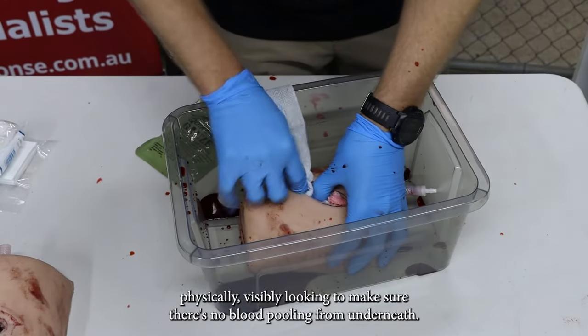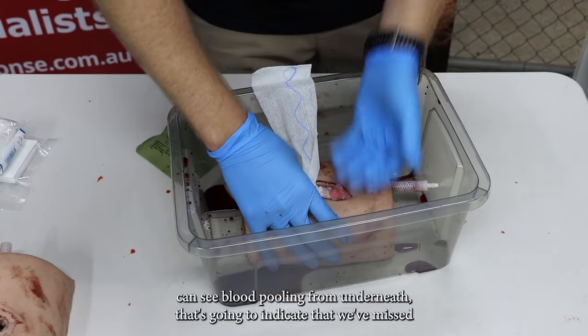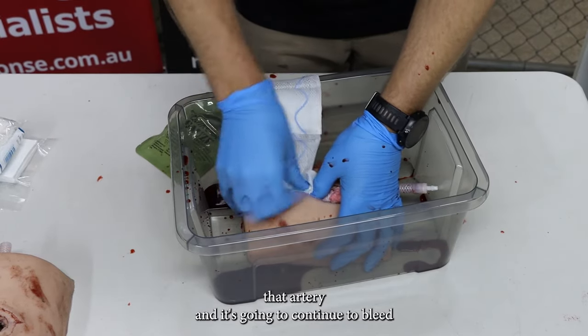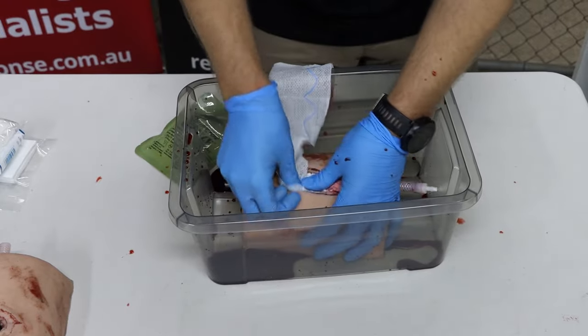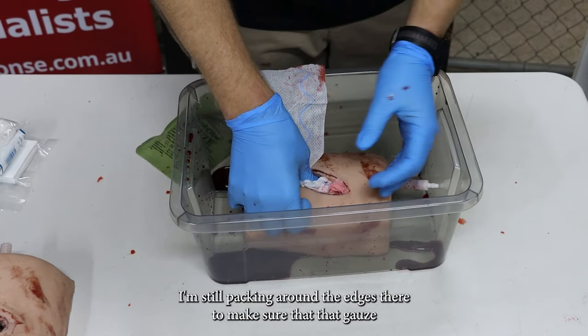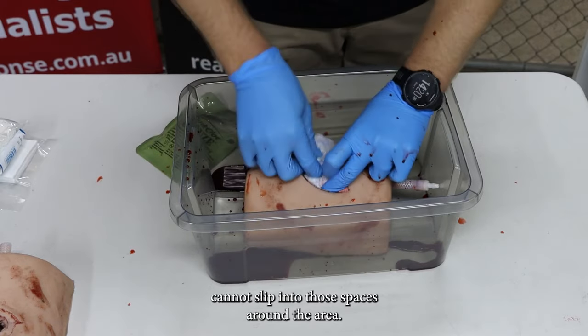So it's really important that when we're doing this packing we're physically and visibly looking to make sure there's no blood pooling from underneath. If we can see blood pooling from underneath, that's going to indicate that we've missed that artery and it's going to continue to bleed. So even though that wound is now completely full, I'm still packing around the edges to make sure that gauze cannot slip into those spaces around the area.